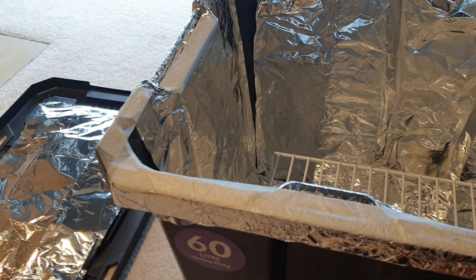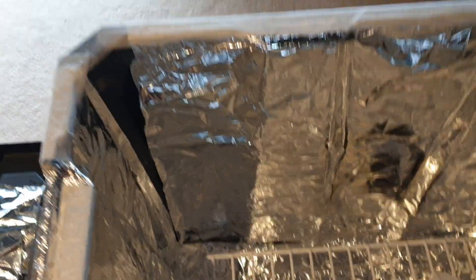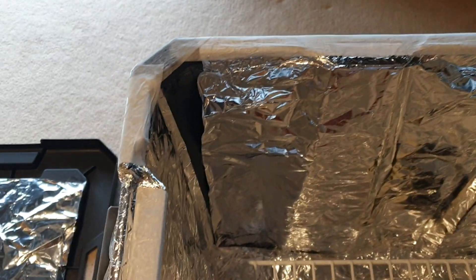The light goes at the bottom. Then I put the KN95s on the dish rack stand, placing the masks on like so.